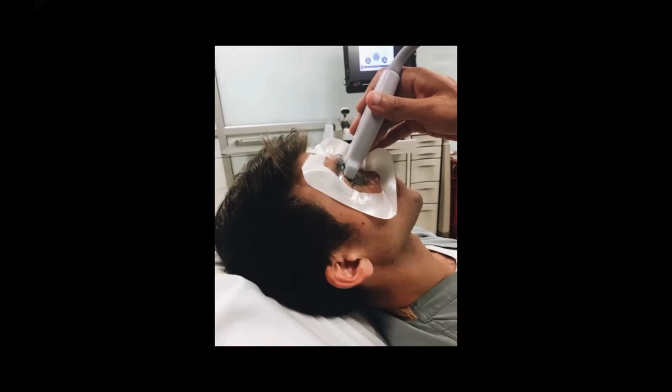And in the absence of significant harm, it's not 100% necessary. So I'll let you guys make up your mind as to what you want to do in terms of Tegaderm or no Tegaderm. I tend to like the without, and just tell the patient to close their eyes and give them a warm washcloth at the end. Did that on myself the other day, and I can still see out of both eyes. But if you want to use a Tegaderm, I certainly will not look askance at that as well.